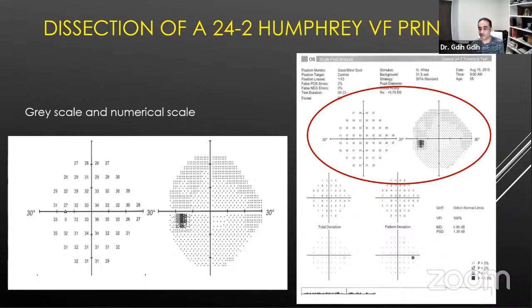That's when you see that number on the visual field machine, and then you ask the patient how they feel. They say, you know, doctor, I think my vision is getting worse. That's a very bad sign. And when we see that, we usually need to do something rather quickly, rather than let them keep losing it. And we're going to go more into that in a few slides.